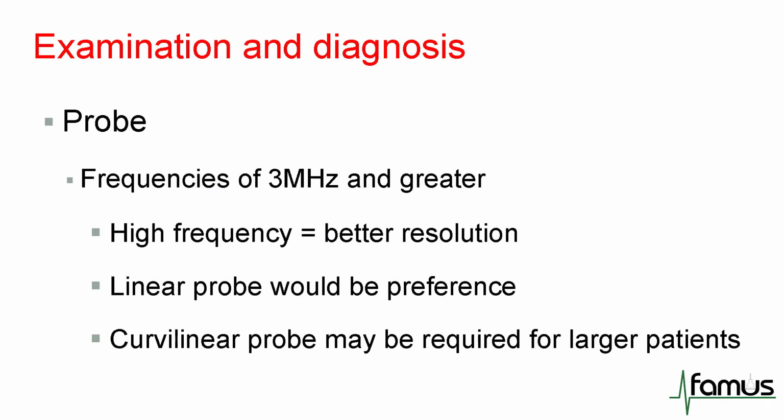We're going to be using a linear probe, which is high frequency and therefore has good resolution. In some patients, particularly with a high BMI, you may need to use the curvilinear probe, which has a lower frequency, but will allow you to see deeper vessels.